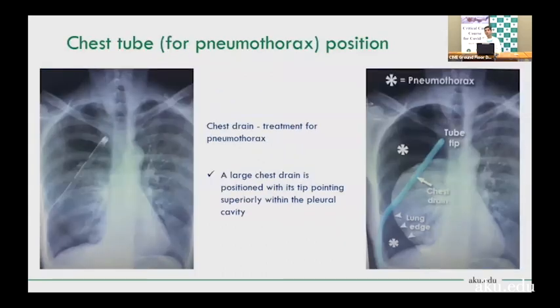Chest tube position for pneumothorax: the tip should point superiorly within the pleural cavity. If placed for pleural effusion drainage, it should point inferiorly toward the base.